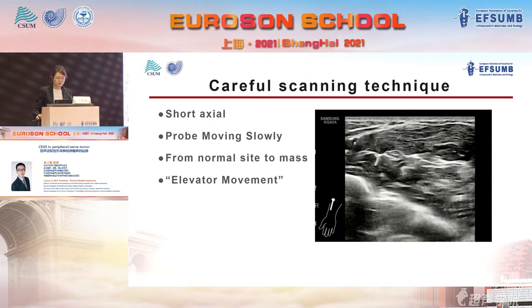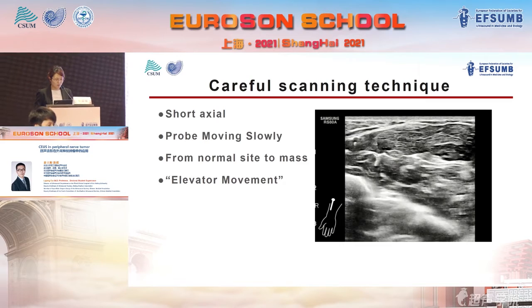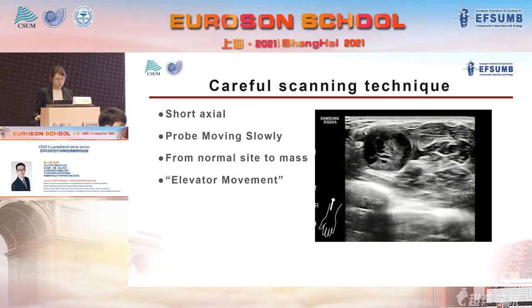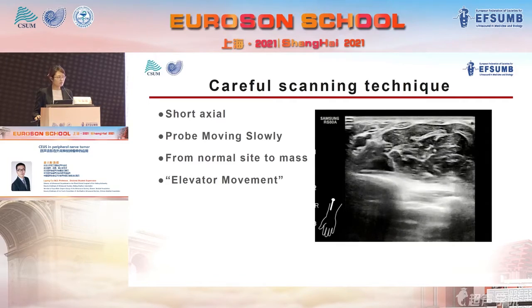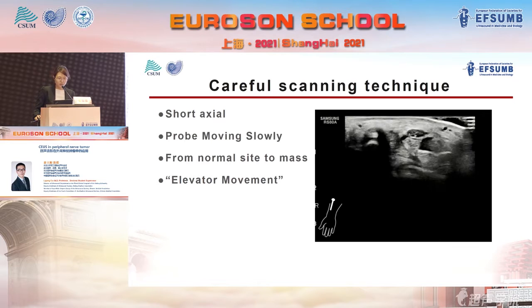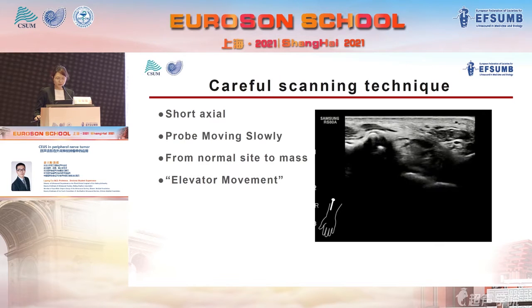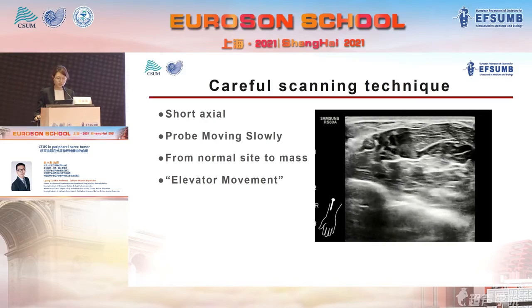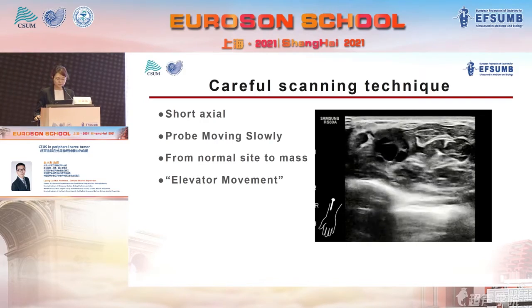And there are some tips for scanning technique. We usually use the short axis, and we move the probe slowly from the normal side to the mass, and we can feel the probe is slowly raised. We call it the elevator movement.